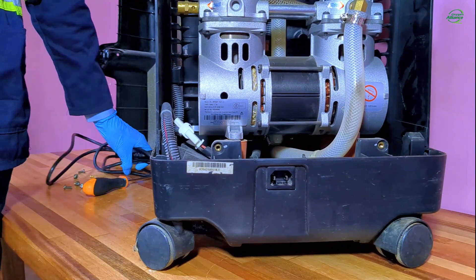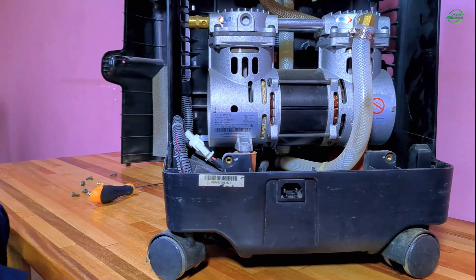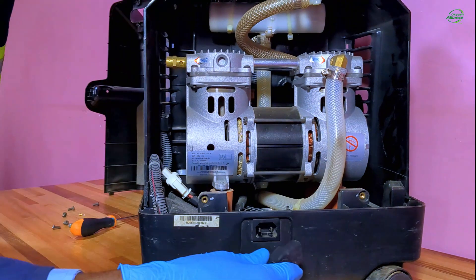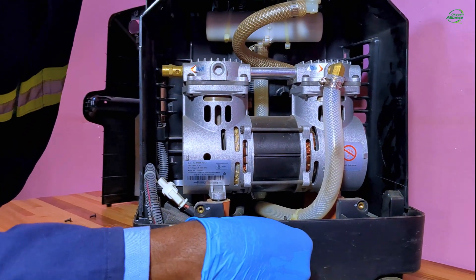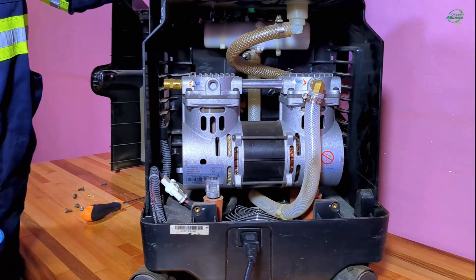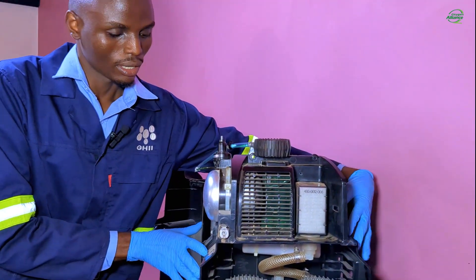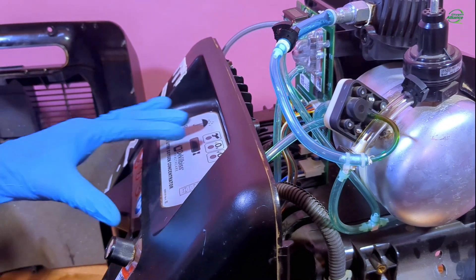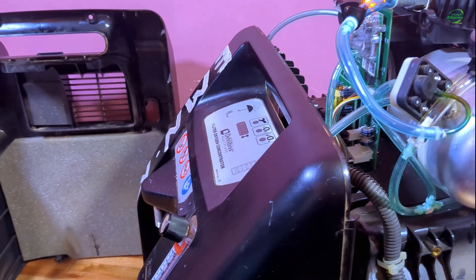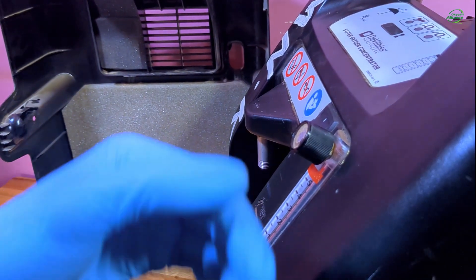Now I will connect the oxygen concentrator to power using the power cable. Now I will turn on the oxygen concentrator. For this model, the maximum flow rate is 5 liters per minute.